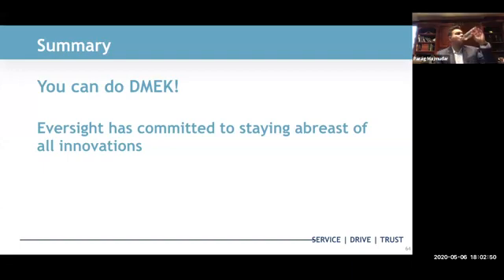Okay, and this will be our last question. What is your choice of DMEK graft size? Right. So in the past, when I first trained, it was 9.5 because that's what they were using. And it looked beautiful because the entire cornea was covered.